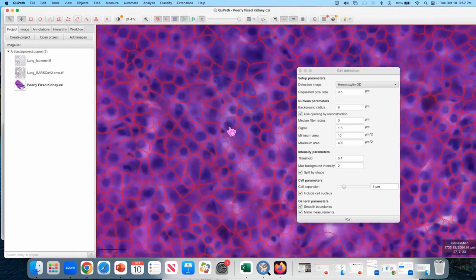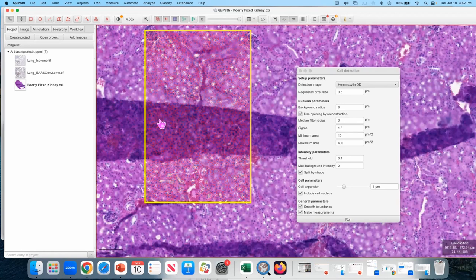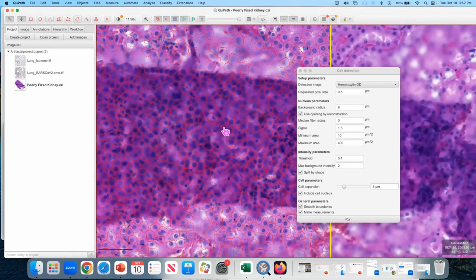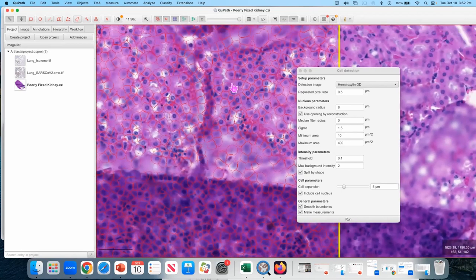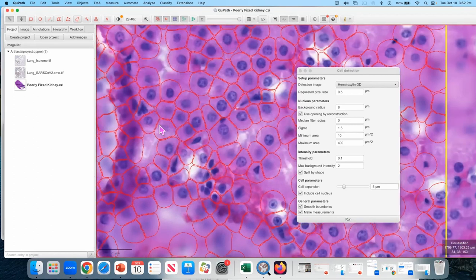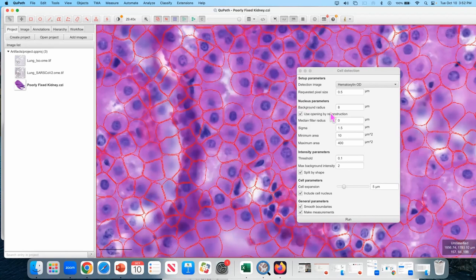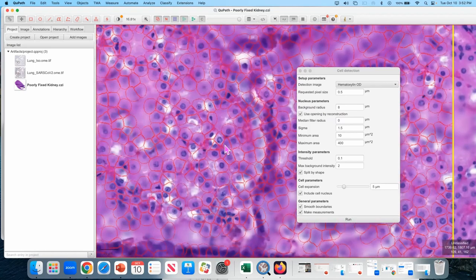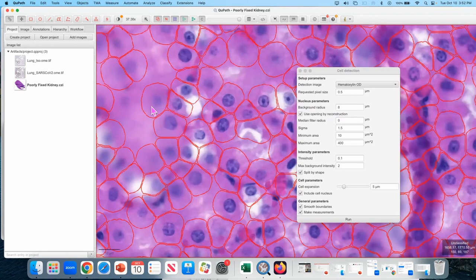And when you have a really bad fold, there are going to be some cells that are on the top, some cells that are on the bottom, and it's going to look like that. Interestingly, some of those nuclei, although you only see the shadow of them, can still be detected. That's partly because there is some smoothing that goes into the cell detection, so the image is actually not that terrible for QuPath. But if you want to make some kind of measurement on that, that's probably not going to be a very accurate measurement.